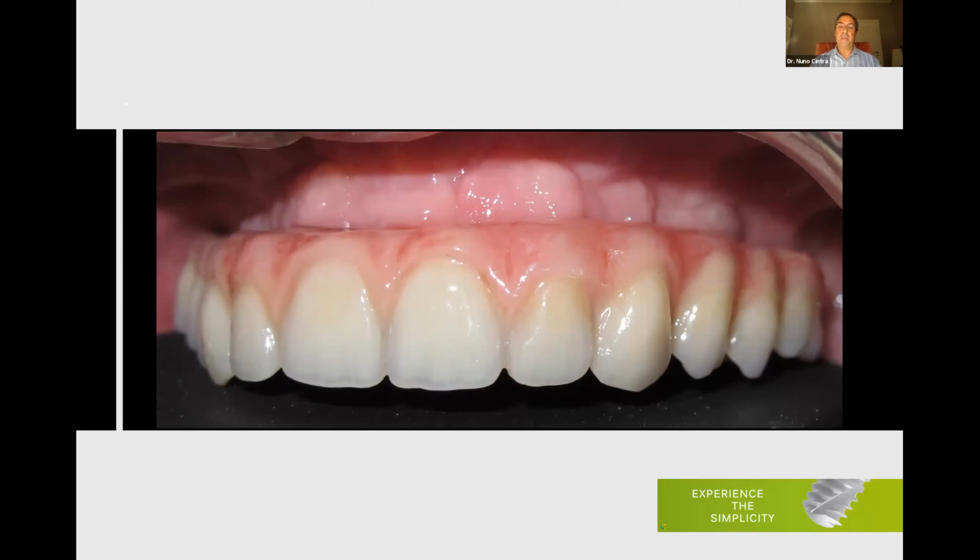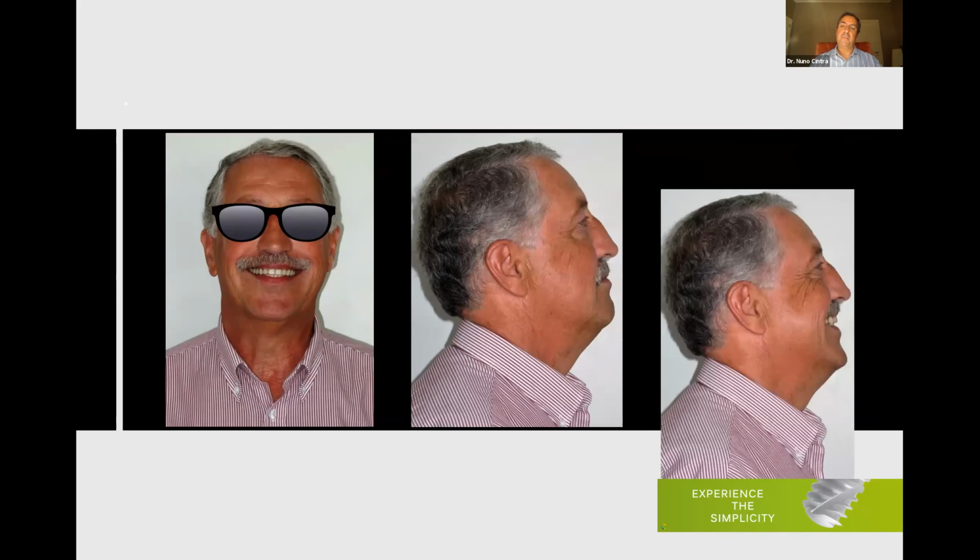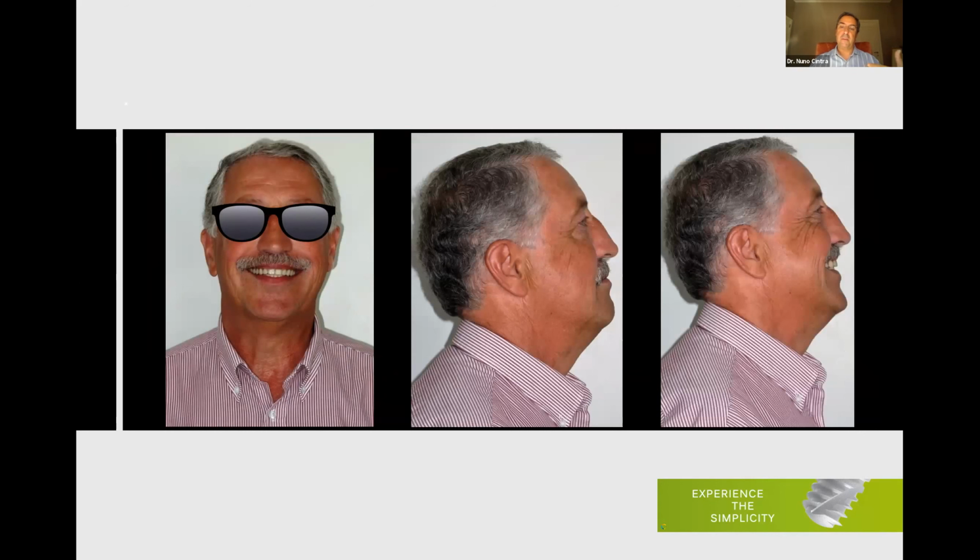But anyway, the patient is able to keep everything clean, and is happy with the solution. And we were able to uncover the transition zone on one aspect, and on the other aspect to bring the lip forward. So the prosthesis is bringing the lip forward, it's giving lip support, and that is possible due to the bone reduction that we have to do during surgery.